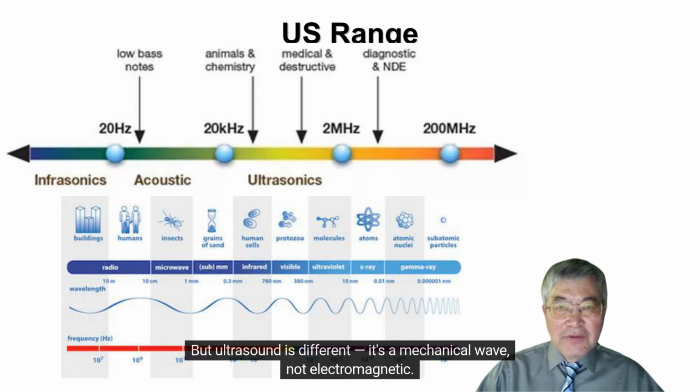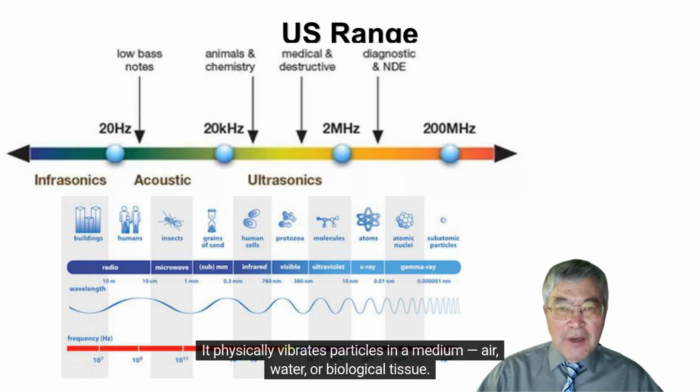But ultrasound is different. It's a mechanical wave, not electromagnetic. It physically vibrates particles in a medium, air, water, or biological tissue. That's why it needs a medium to travel. It can't move through a vacuum.